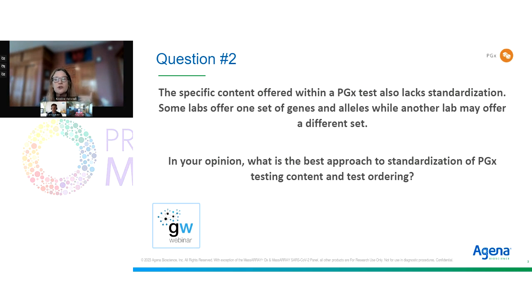But those are key things on the reports, aside from aligning again with CPIC guidance: making sure it's clear what you're testing, and beyond the detail level of star 3, you need to say what's going into that star 3. I think those are the things that I want to keep top of mind.